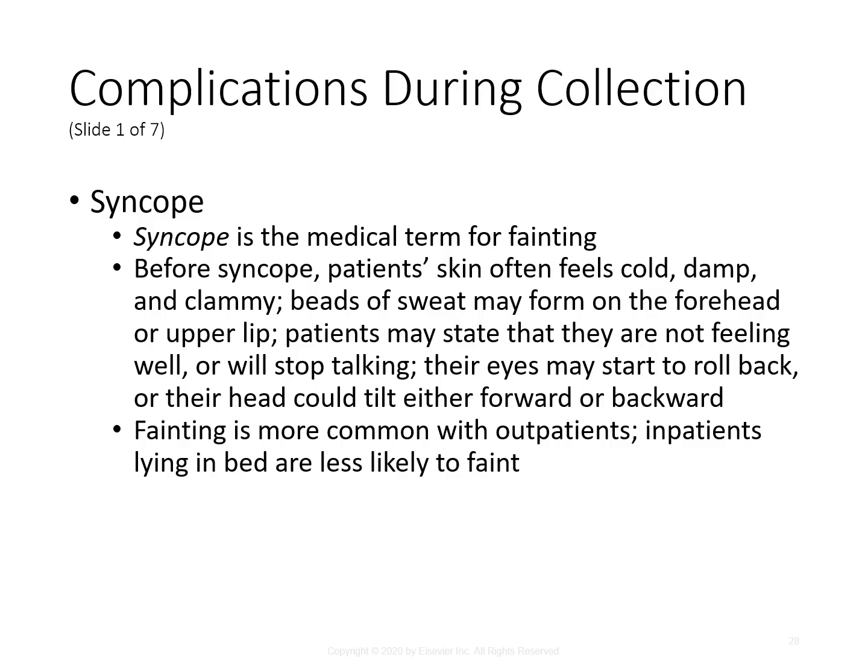So if syncope occurs while you are drawing a patient, make sure you remove the tourniquet and needle immediately and apply pressure to the site. Outpatient draw areas should be equipped with pillows and blankets just in case this does happen. And if a patient does faint, make sure we document this as well.